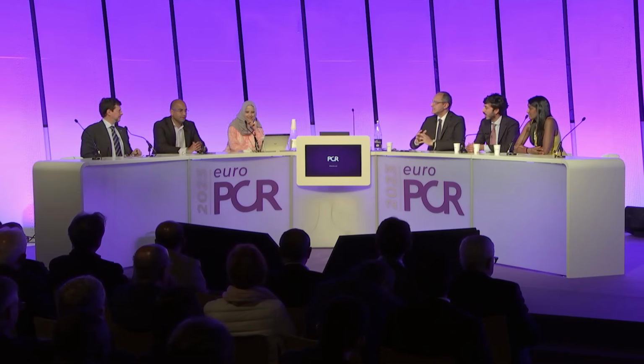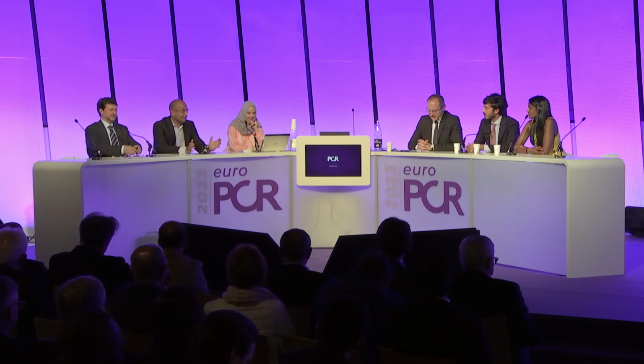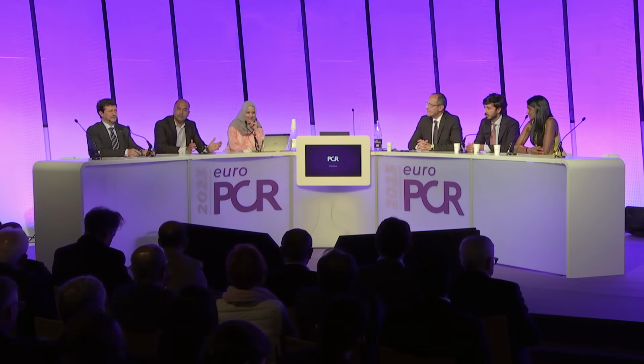From my perspective, the challenge with this case is the length of the calcium. You probably could do it with balloon. You could probably do it with IVL, but you're going to struggle with guide extensions and pushing and multiple catheters, et cetera. And so cases like this, heavy calcium is important. There was actually a comment in the chat about could you use the angiogram to define the thickness of the calcium? You could, especially with stent enhancement systems, but you won't know length, circumferentiality, and whether it's superficial or deep. So unfortunately, there's no substitute.